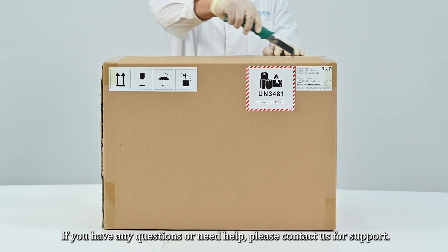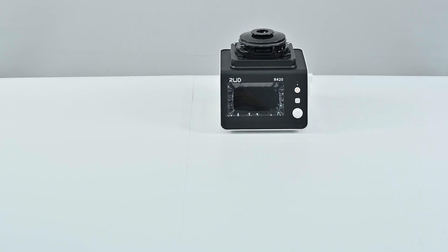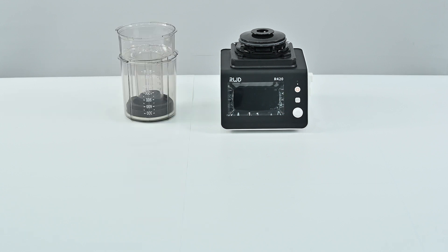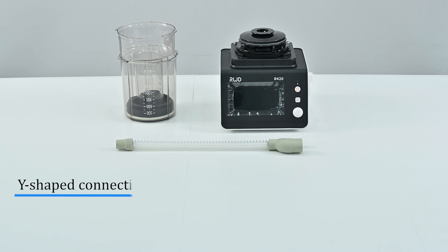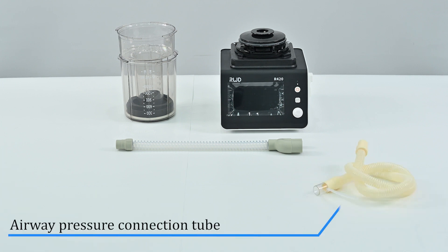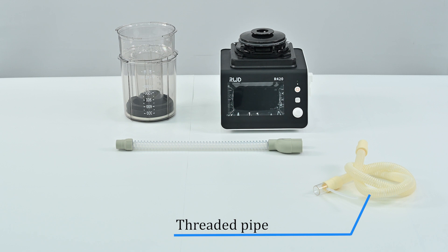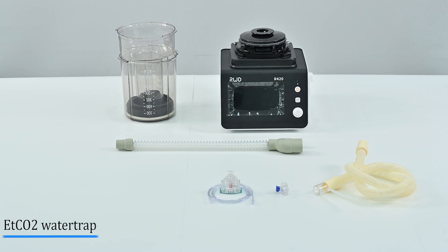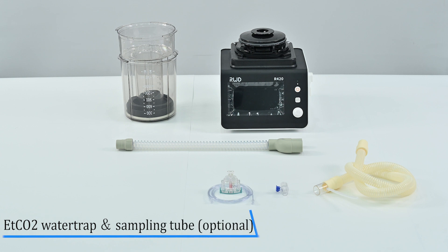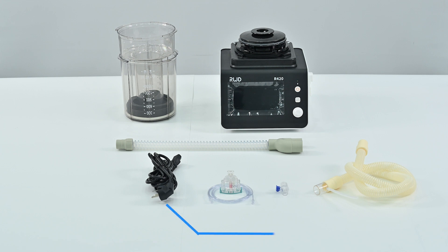The package includes the mainframe, cover and bellows, Y-shape connecting pipe, airway pressure connection, threaded pipe, V60 straight joint (optional), ETCO2 water trap and sampling tube (optional), and power cord.